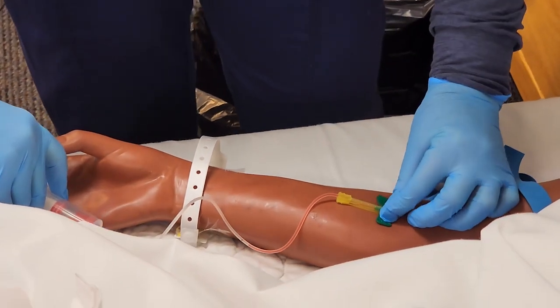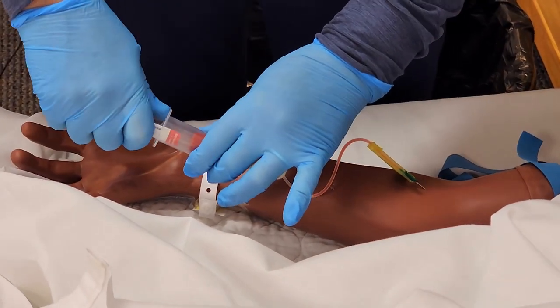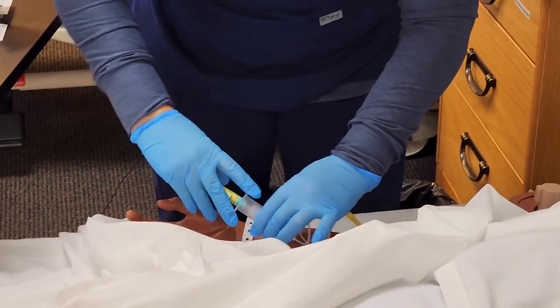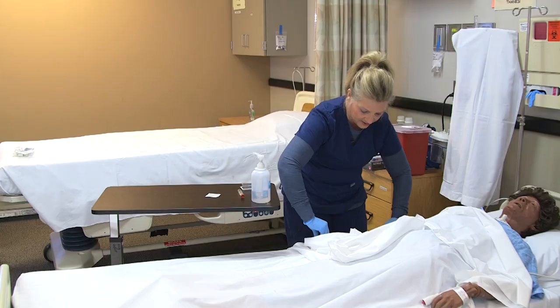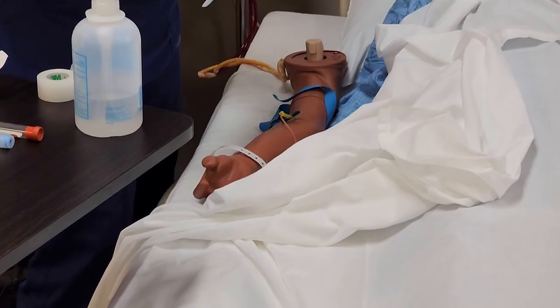Because this is a mannequin, it may not fill as it should in practice. Once you get each tube to the correct amount, invert it, set it aside, and then place the next tube on. That will fill your next blood tube. Remove it and invert.